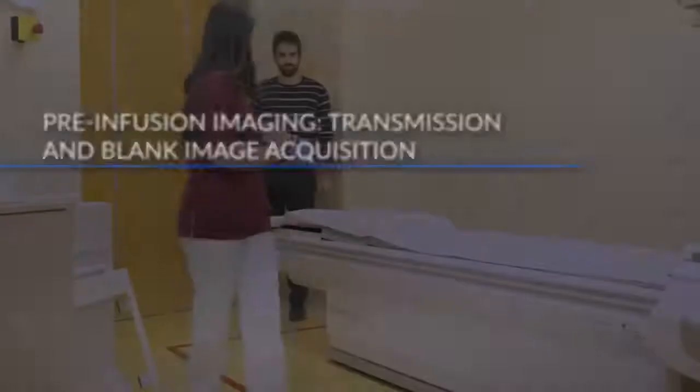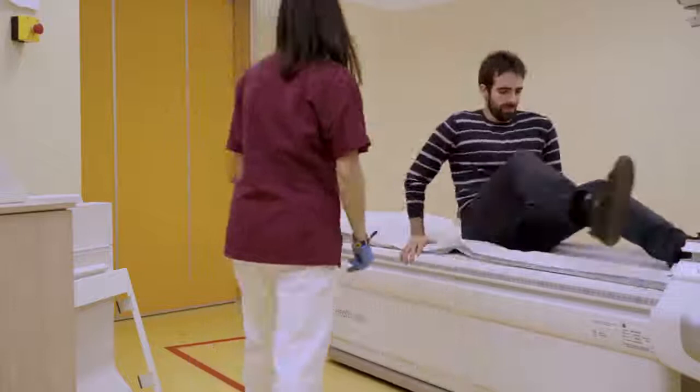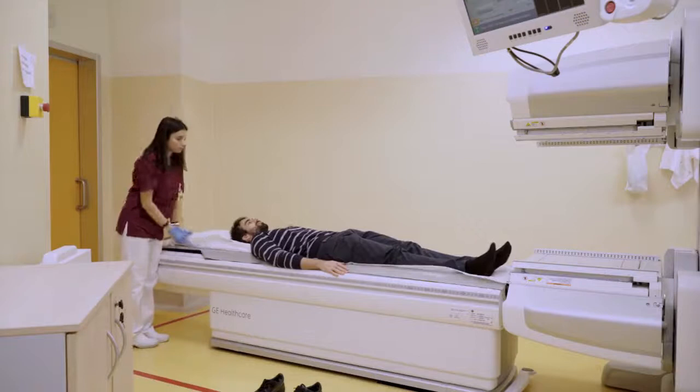To evaluate the patient's water equivalent thickness for the attenuation correction of counts derived from 2D planar images acquired after radioligand injection, position the patient on the couch in a feet-first supine position with arms at rest along the side of the body. It's important to find a setup that is comfortable for the patient, as they must remain still for the entire acquisition time.